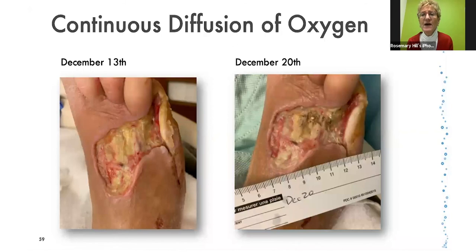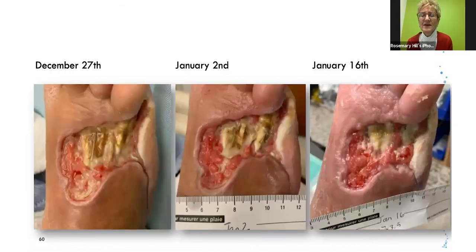Again, this is now only several weeks later, but you're definitely seeing the transformation to that wound bed. And the next slide. And this is, as Kathy mentioned earlier, that red tissue, maybe it looks on the picture as if it's hypergranulation, but it's actually very sturdy, robust granulation tissue, and it is not that friable. And so we persisted, and now we're just a month out, and we've got this gorgeous wound bed. And indeed, it's looking very optimistic at salvaging. Next slide.